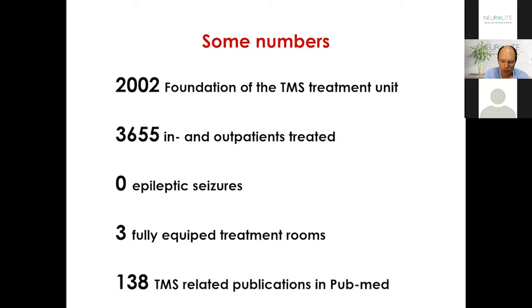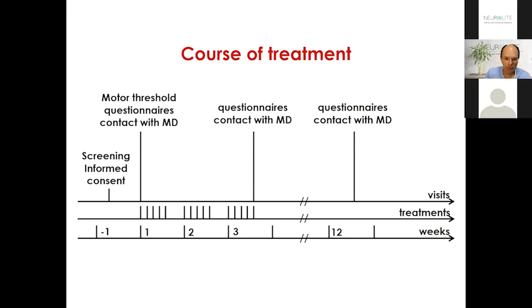From the very beginning, we also evaluated the TMS treatment scientifically, and we have many publications on this topic. But it really comes from the clinical need, and over all the 20 years we were interested both in further developing TMS, doing scientific research, but also in using it in clinical practice.